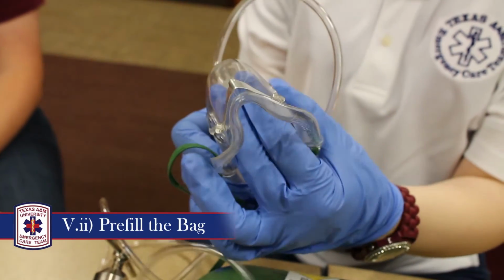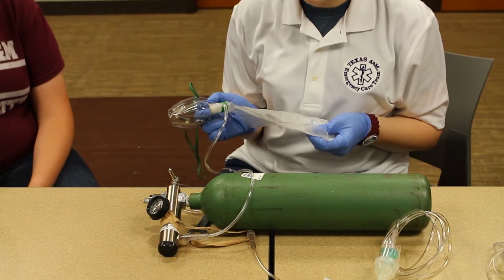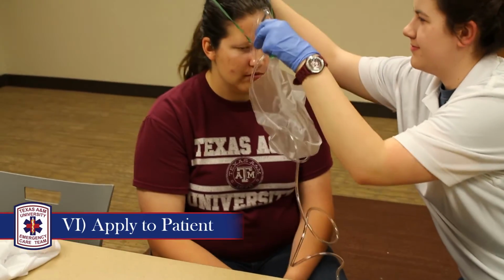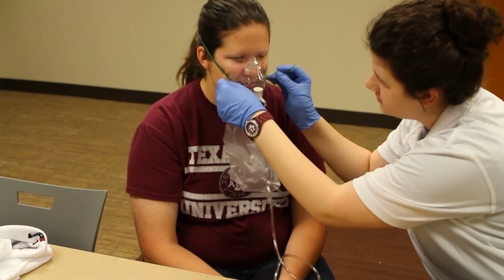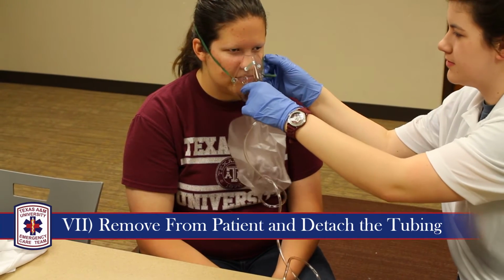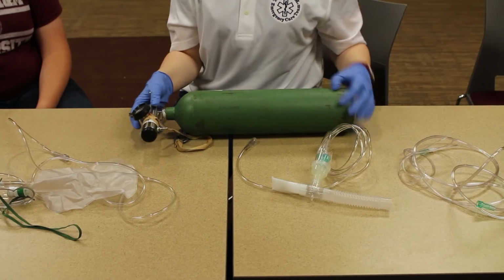Make sure you pre-fill the bag so that the patient has some volume to breathe with. Next, apply the mask to the patient by fastening the straps around the head and tightening the two metal prongs around the nose. To remove, pull the mask away from the face and pull up. Make sure not to slap the patient with the straps.